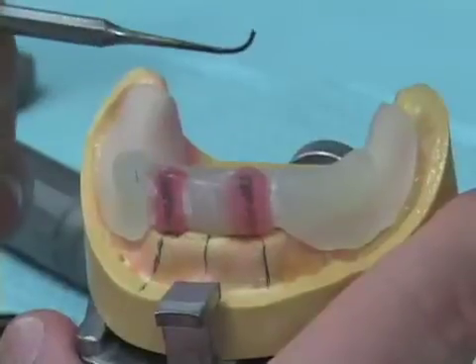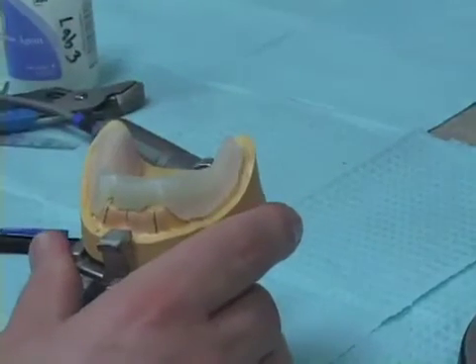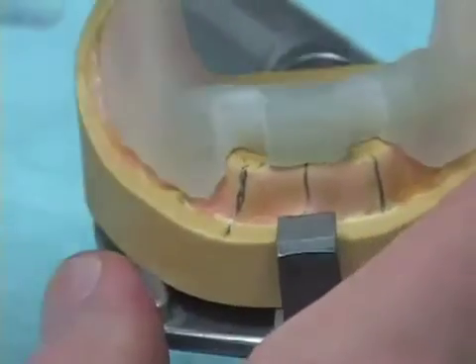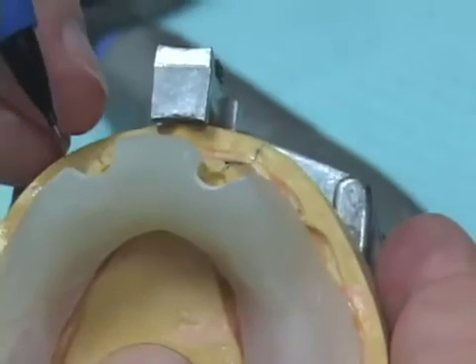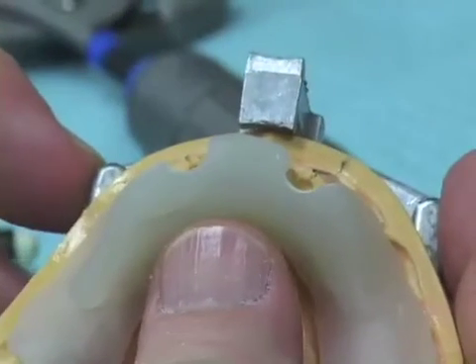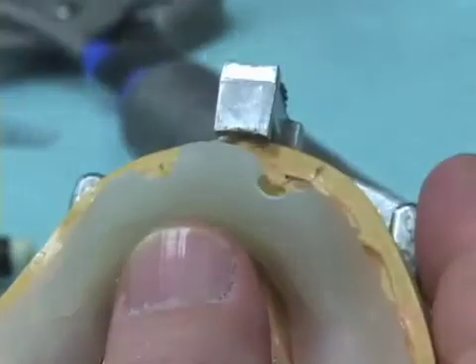And now we're going to proceed to make our surgical guides. Initially, we adapt some triad and take the 4.2 millimeter drill blank and just push it into the uncured triad, creating these depressions in the area where we want to place the implants. And you can see from above that we have our record base made, and there are these depressions that were created by just taking a drill blank and supporting the lingual aspect with our fingers or our thumbs and just pushing the soft triad back.